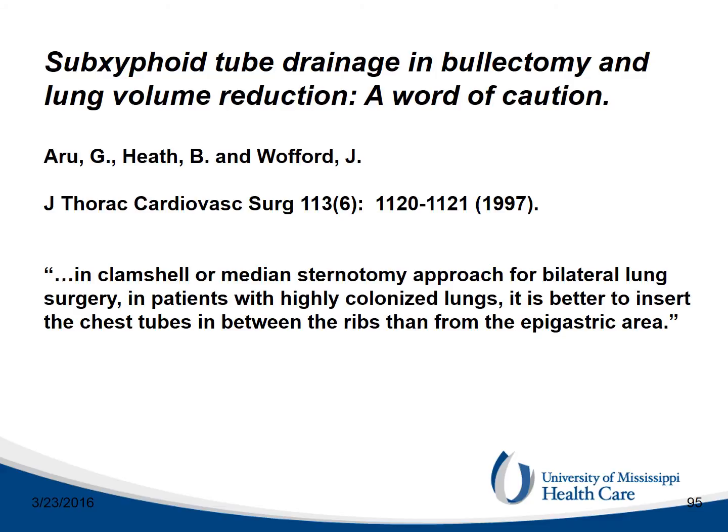We have encountered a rare complication after bilateral bullectomy done through a sternotomy approach. The chest tubes at surgery were inserted in the subxiphoid area and the patient developed an infection of the xiphoid cartilage, possibly as a result of a highly colonized lung. Due to this, in this type of patient with a high number of bacteria in their lungs, we now rather insert the chest tubes in the intercostal space, since the intercostal muscle has better blood supply.